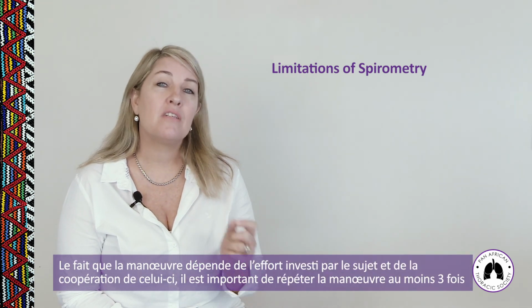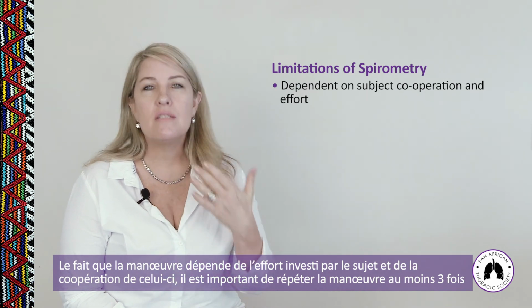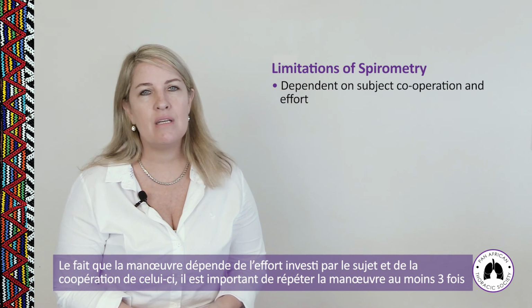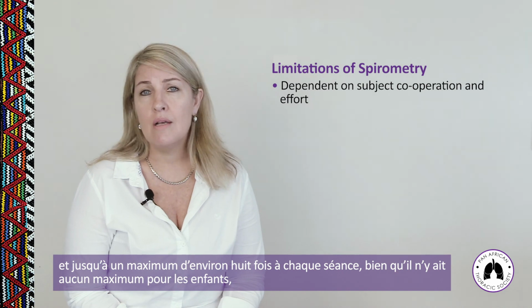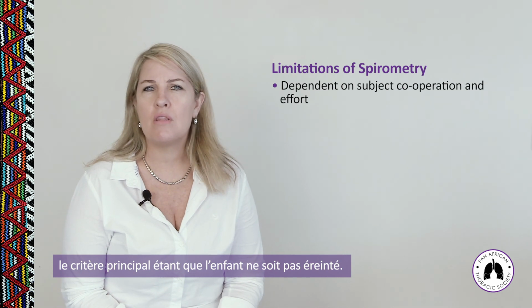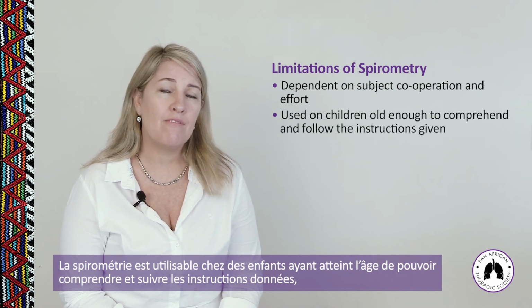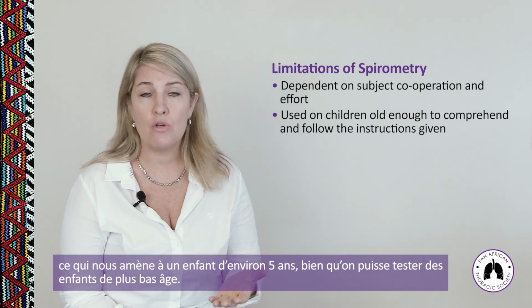Because the maneuver is effort dependent, what that means is that it all depends on how the subject actually conducts the test itself. There's got to be cooperation and effort, and for this reason, the maneuver has to be repeated at least 3 times and up to about 8 times in each testing session, although for children, there's no upper level to the testing time. It's really on agreement with the child, and as long as the child is not getting exhausted. So spirometry can be used on children old enough to comprehend and follow instructions, and that's usually around the age of 5, but as I said, we can do it on children who are younger.